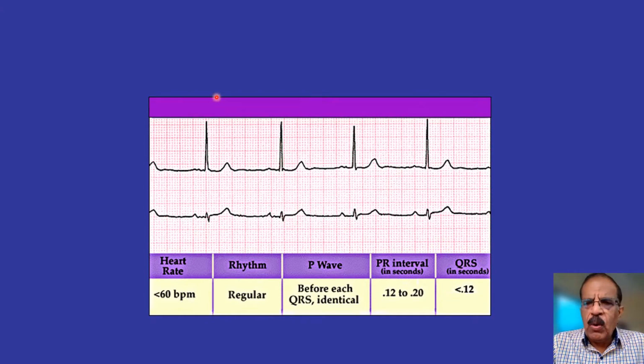So when we talk about the heart rate, we actually talk about the P wave. Of course, the number of QRS complexes in a normal heart would be the same because every P wave is conducted to the ventricle as a QRS complex. So we have as many P waves as QRS complexes, but heart rate is typically calculated from the P wave, the sinus rate. Ventricular rate may be calculated from the R waves. Mostly atrial and ventricular rates are equal, so it doesn't really matter which wave you use.